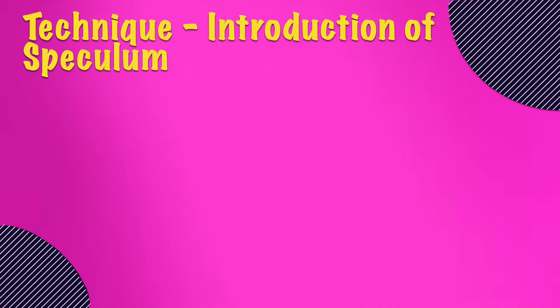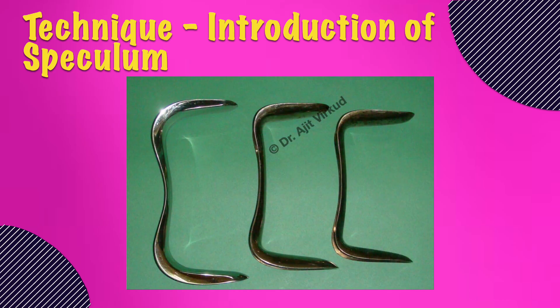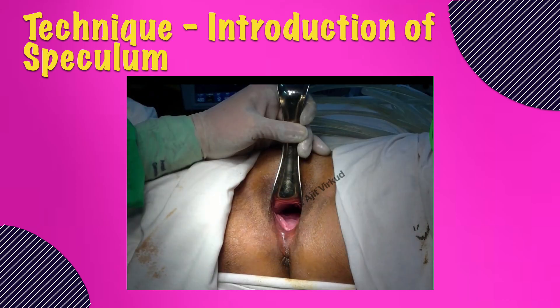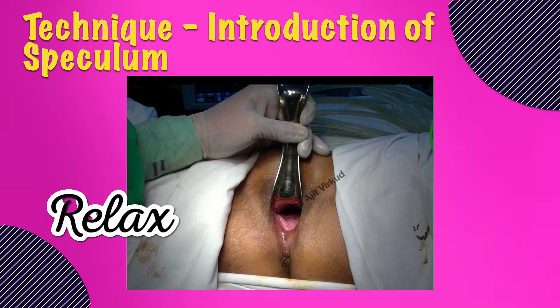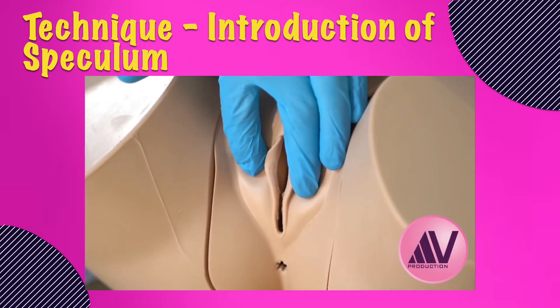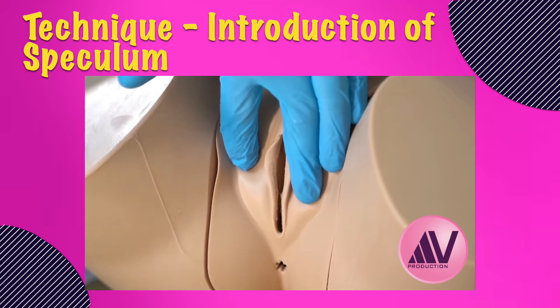The method of introduction is as follows. Sims as well as Cusco specula are available in three sizes: small, medium, and large. Choose the appropriate size speculum. Warm and lubricate the speculum using water-based gel. Ask the patient to relax her body. Hold Cusco's speculum in your right hand. With the blades closed, the handle is placed transversely with the blades aligned along the anterior-posterior diameter of the vulvovaginal outlet.